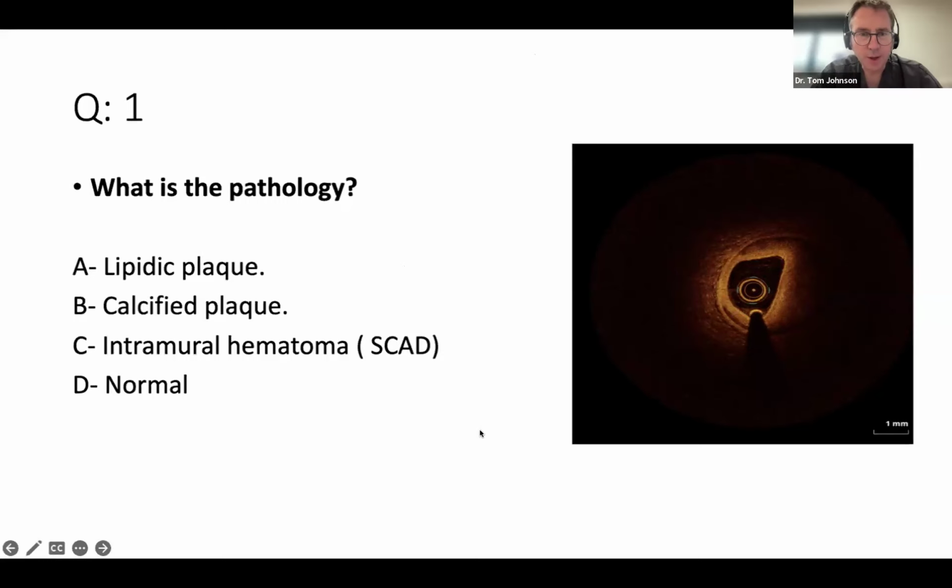Yeah, so just keep in mind, because I think this is really difficult. I think one of the lessons always from these types of quizzes is that it's very artificial to be asked to give a response to a single frame and out of clinical context. So the important thing here, as Magnus beautifully described, is to think about what information you're getting from the light source from the probe, because that's truth, and it's then down to your interpretation. So I think you can justify everyone's answers, as you said.